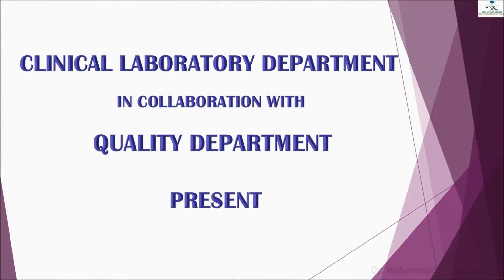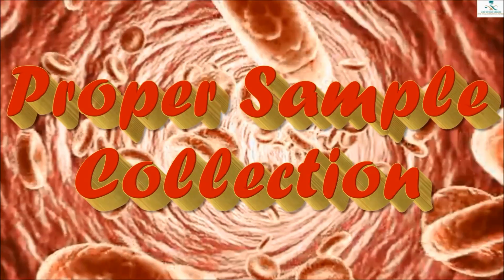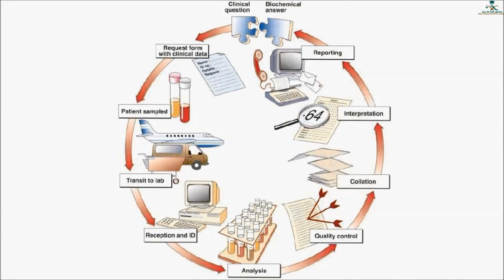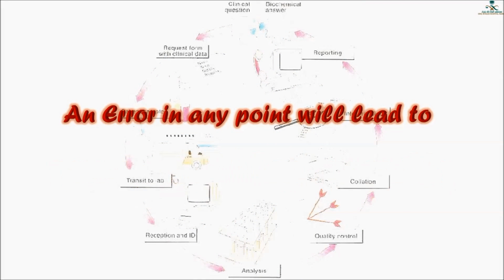Bismillahirrahmanirrahim. In the name of Allah, we will discuss today how to do proper sample collection. Laboratory helps in most of clinical situations. Laboratory tests pass through many steps. An error in any point will lead to wrong lab test results.